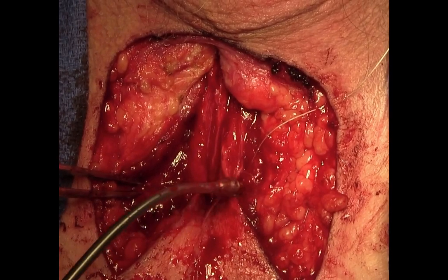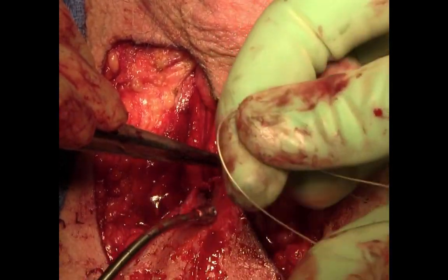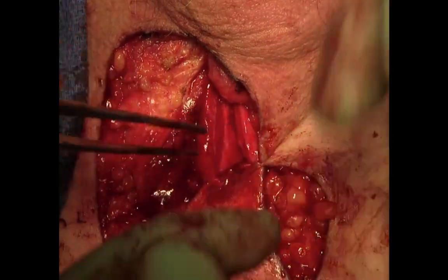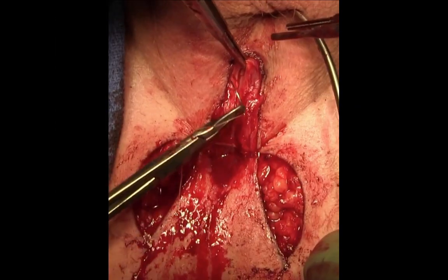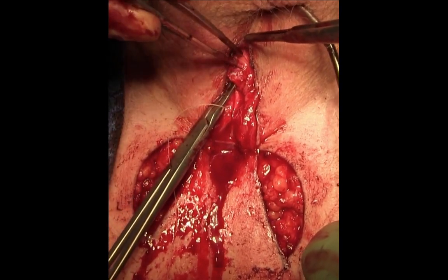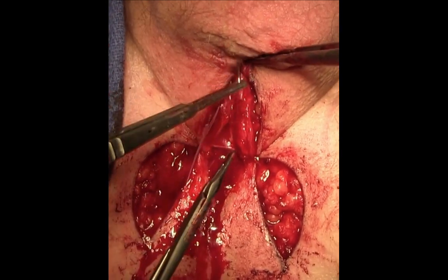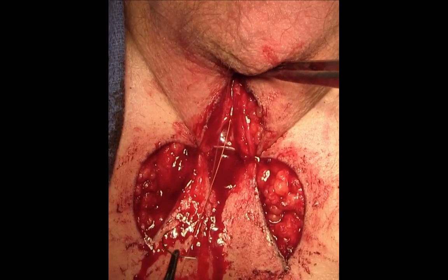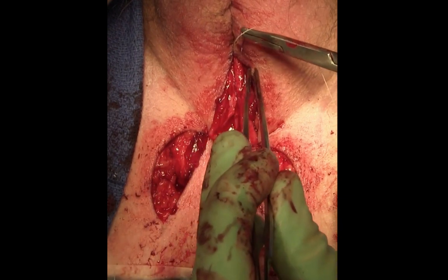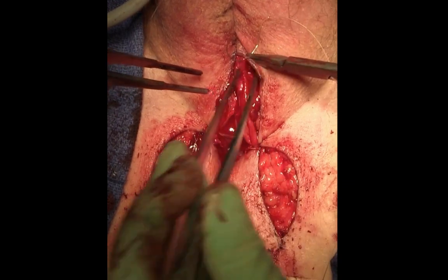It's very helpful to have the assistant pull the lateral skin of the perineum down, so a knot can be created that is tension-free. The distal urethrotomy is extended to meet the scrotal incision. The overall length of the perineal urethrostomy should be close to 5 centimeters. This contracts substantially over time, and starting out with a large perineal urethrostomy will hopefully prevent contraction in the future to the level where restenosis occurs.